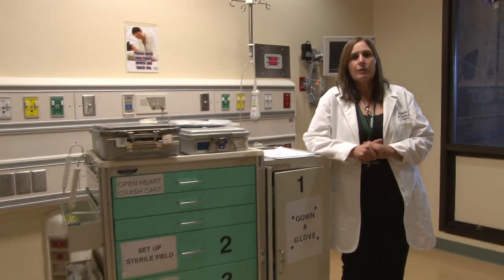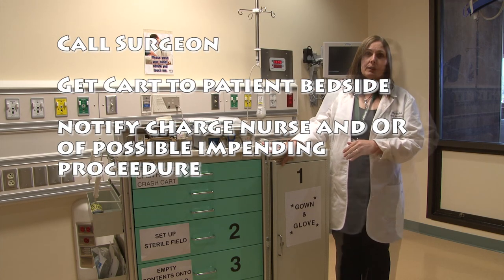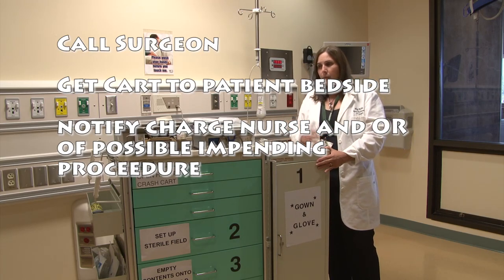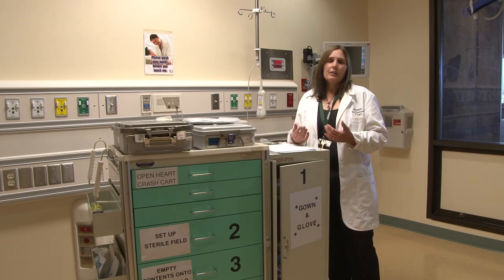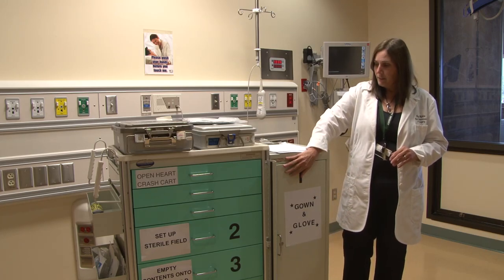A lot of times you'll be managing a patient with a resident, and you'll have a better feel of when it's time to call the surgeon than they will. So you call the surgeon, and he says he'll be right down. What are you thinking you want to do to prepare for what might eventually happen next? Hopefully you're going to say you need the cart — you may end up opening the chest at the bedside — and you might need some OR nurses. Here at the VA, it takes at least a half hour to get OR nurses back. We don't have 24-hour nurses, so it's up to the bedside nurse. You may feel some anxiety — you haven't opened a chest in two years — but don't worry, because we have the one, two, three method and you remember it from class.